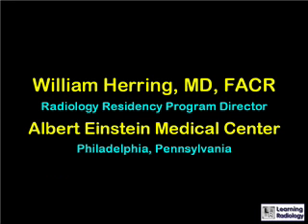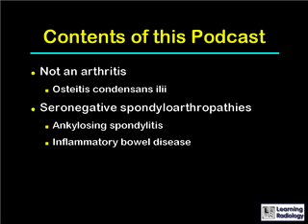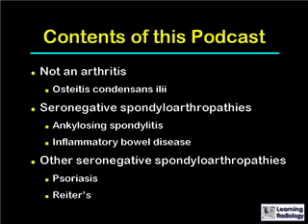Sacroiliitis. Hello, I'm William Herring from Albert Einstein Medical Center in Philadelphia. In this podcast, we're going to talk about osteitis condensans ilii, which is not an arthritis, and then several arthritides: the seronegative spondyloarthropathies, ankylosing spondylitis and inflammatory bowel disease, and other seronegative spondyloarthropathies, psoriasis, and Reiter's.